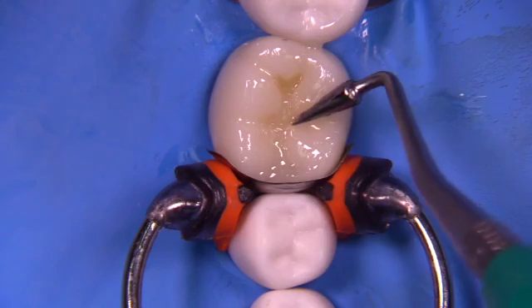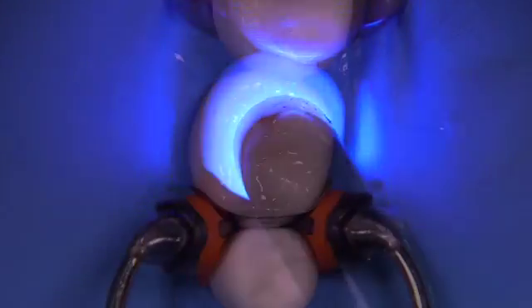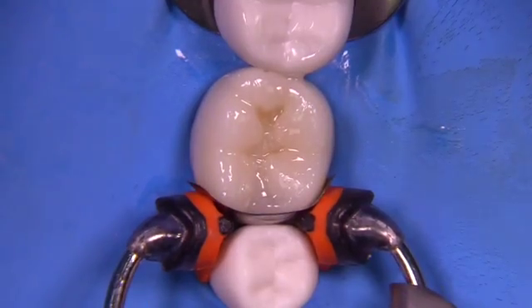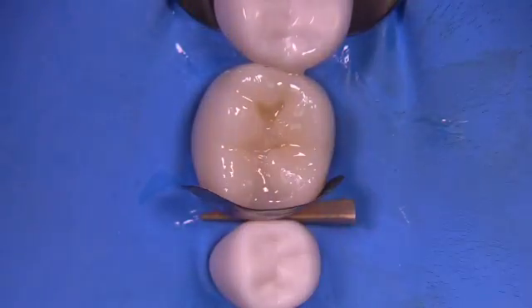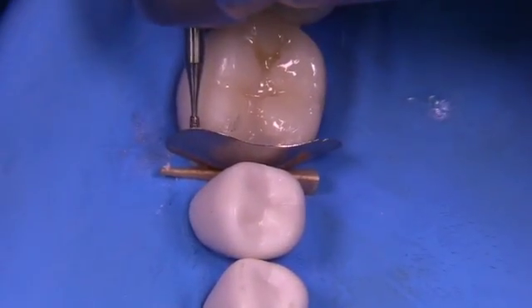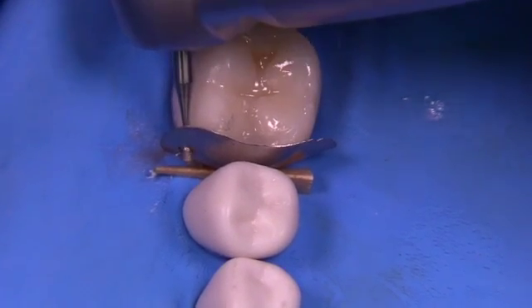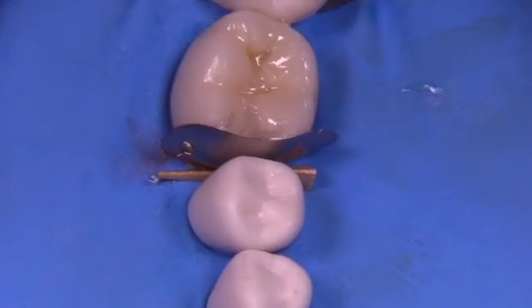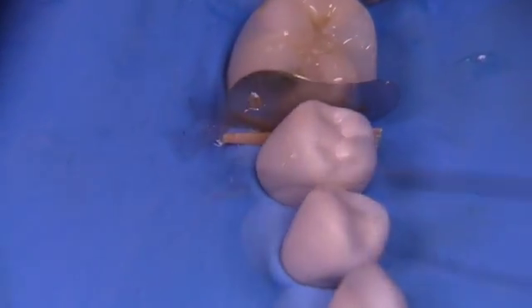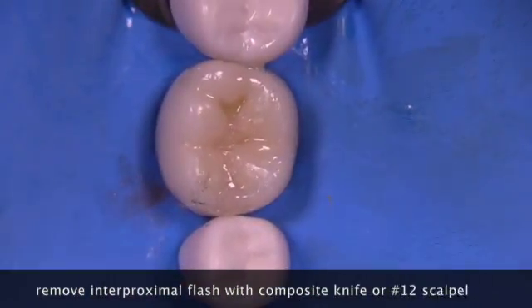Then it's just a matter of shaping it. We can use a variety of different instruments to create the anatomy that we want. Now we're ready to remove the matrix assembly, starting with the G-ring first, and then after that we're going to take out the wedge. What I like to do is place a small hole — if one is not present in the type of matrix you're using — with a little 330 diamond to get access to the band because it's quite tight.